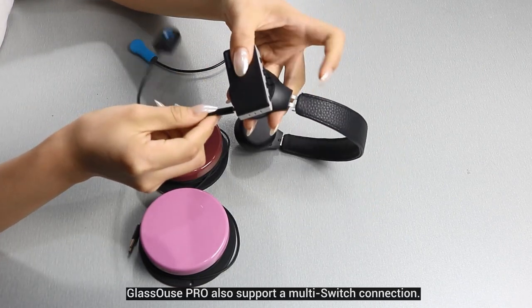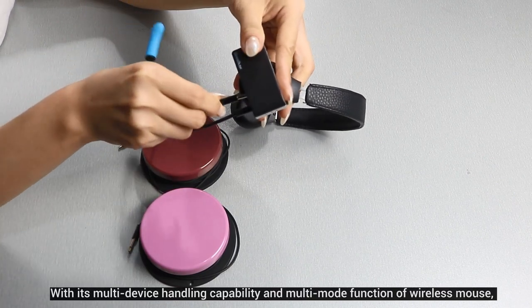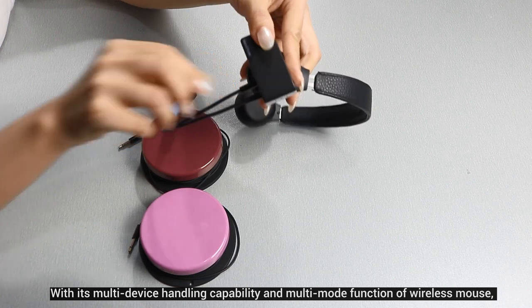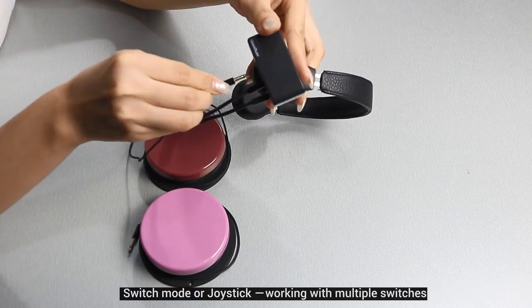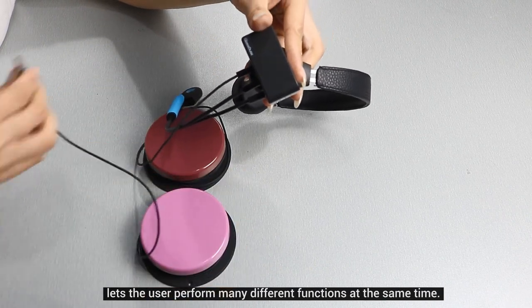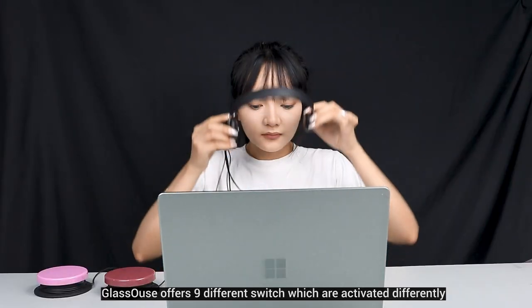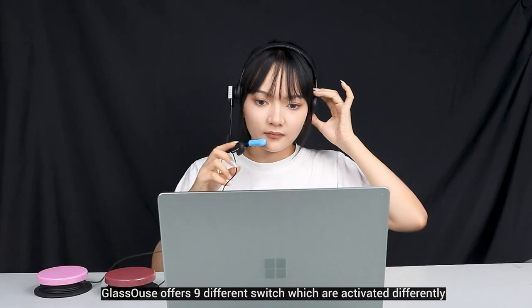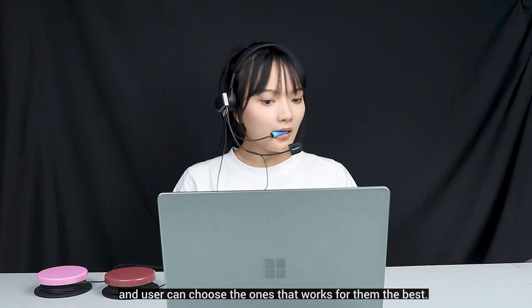GlassOuse PRO also supports multi-switch connection. With its multi-device handling capability and multi-mode function — wireless mouse, switch mode, or joystick — working with multiple switches lets the user perform many different functions at the same time. GlassOuse offers nine different switches which are activated differently, and users can choose the ones that work best for them.